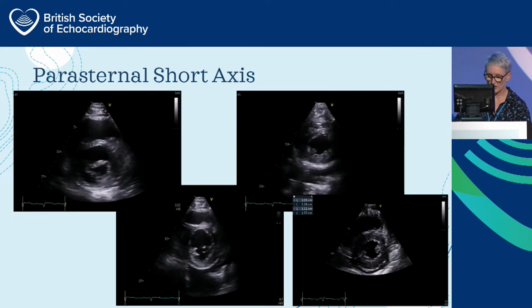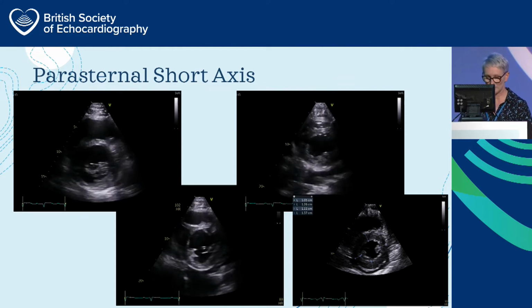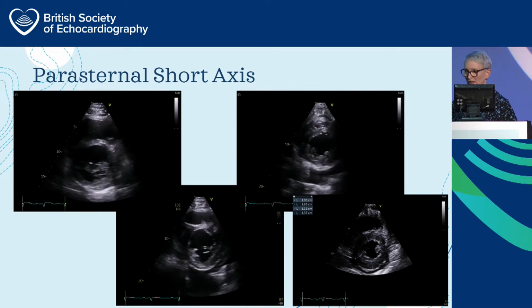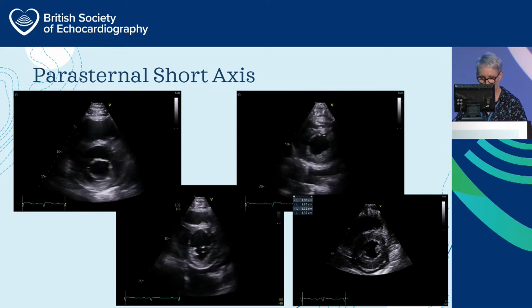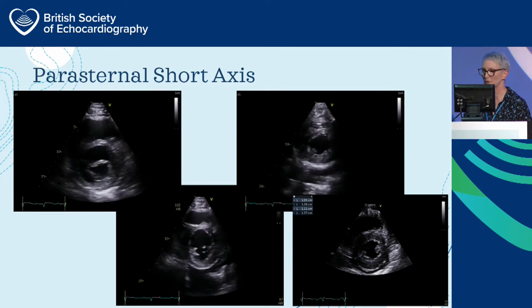Moving on from parasternal long axis, we continue our assessment of the left ventricle in the parasternal short axis views, where we can visually assess the radial function of the base, the mid and the apical levels of all walls of the left ventricle. We can also make wall thickness measurements, which might be required if we were following the hypertrophic cardiomyopathy data set in the clock phase.